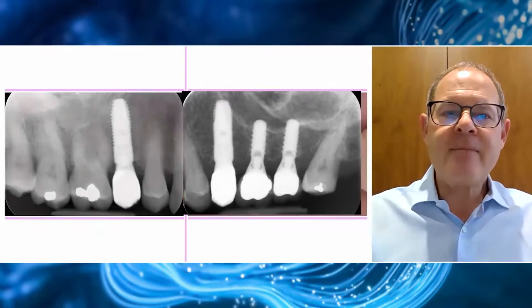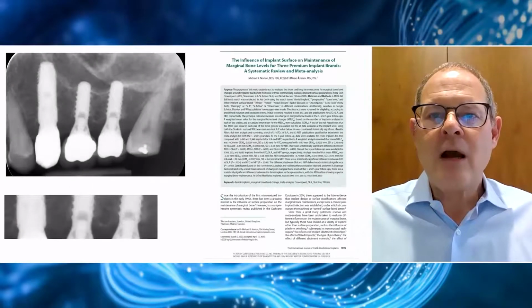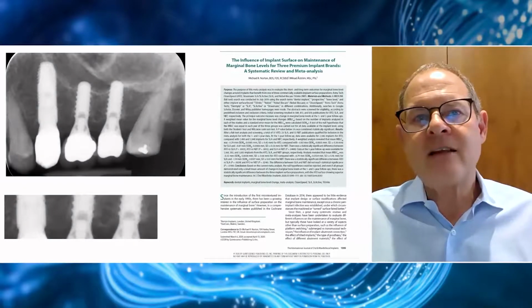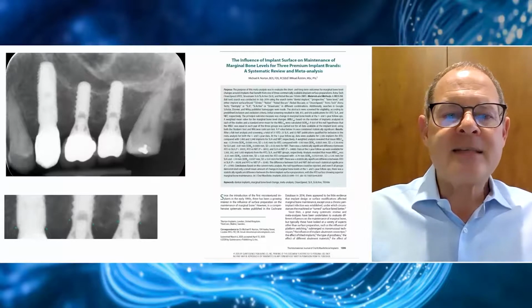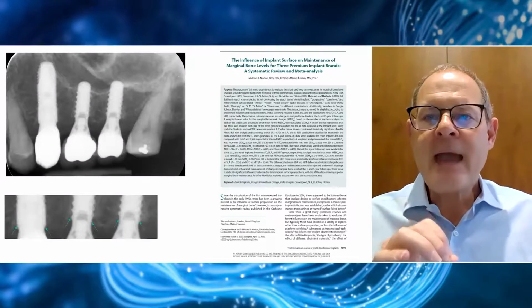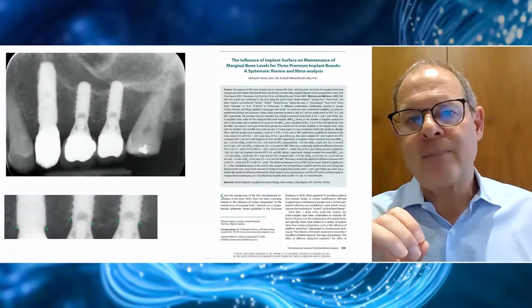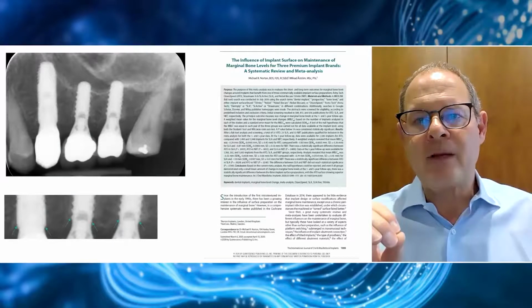And to that very point, I would like to share with you a brand new study that has just been published in the Journal of Oral and Maxillofacial Implants, where I did a systematic review and meta-analysis to look at the marginal bone levels when comparing the surfaces of 3 premium brand implants, those being, of course, Astra, Nobel, and Straumann.